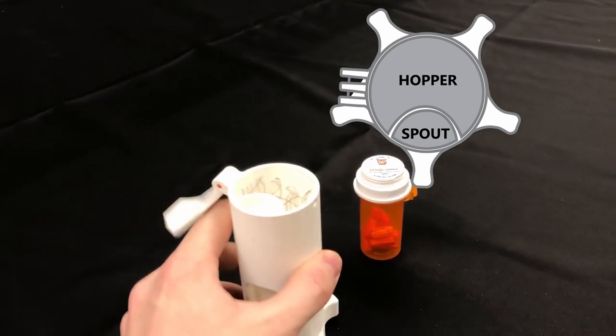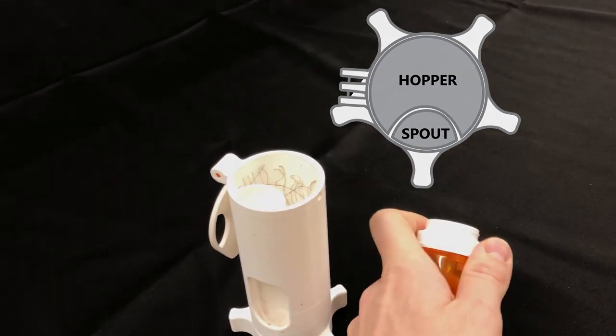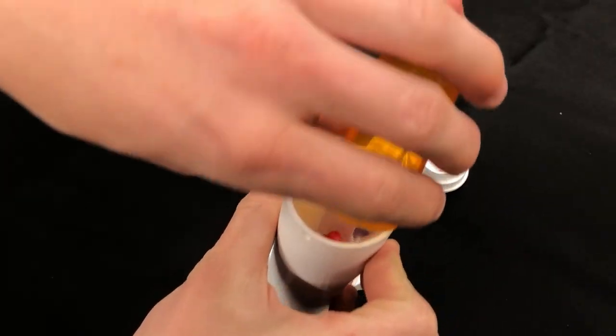The larger opening is the hopper. Pills can be poured into the hopper section. The top cap can then be closed back up.